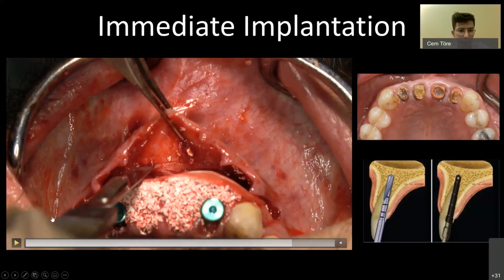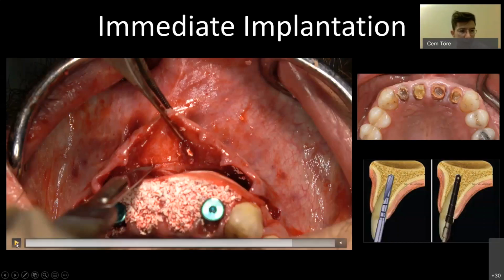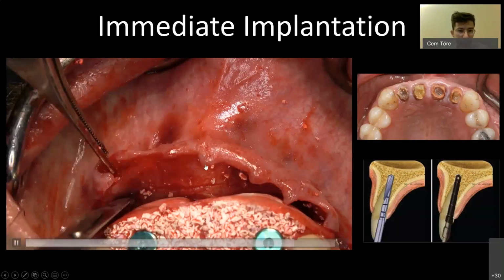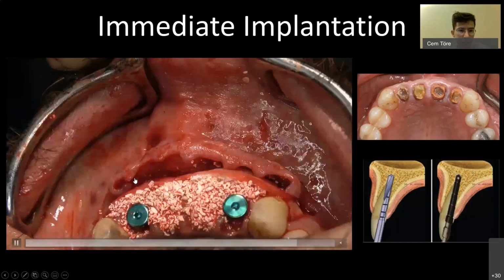This is a releasing incision. This is something we have to do every time, whenever we are altering the contour of the bone from the buccal side or from a height perspective. We will simply otherwise not be able to make the ends of the flap meet properly if we don't do this. What we are doing is placing an incision at the base of the flap, not in the middle, not around the flap edge, but at the very base.